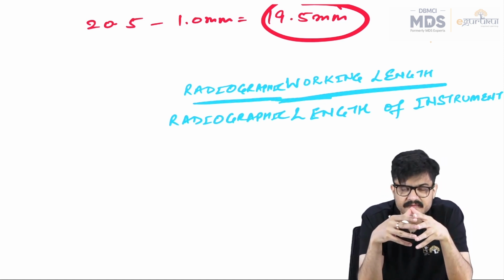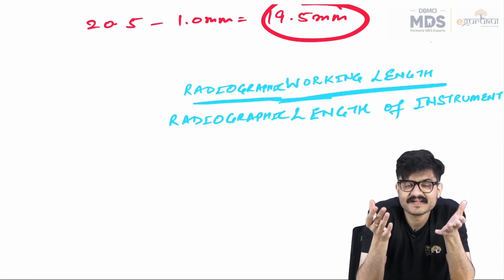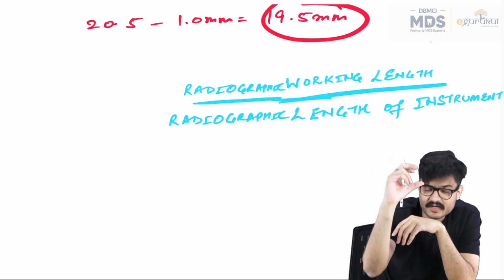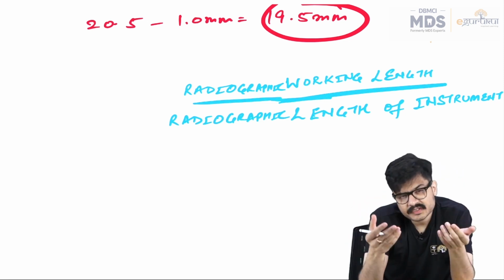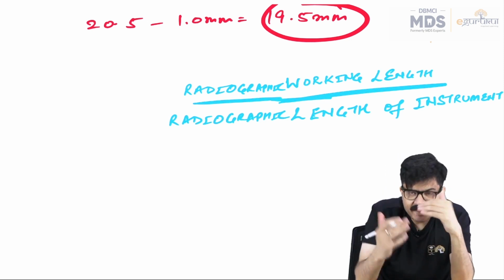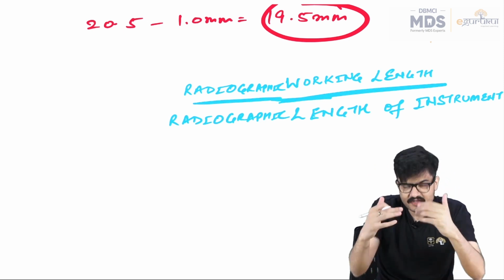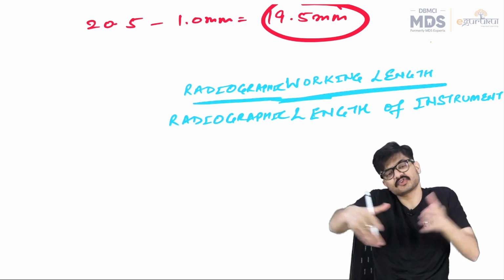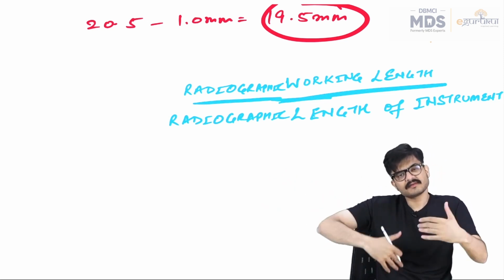This basically means that if I have an X-ray which is distorted, right, friends? On that distorted X-ray, my numerator would also be distorted by the same amount as my denominator. So this ratio would not vary. When we're talking of ratios, even if I have a distorted image, the numerator and the denominator would be distorted by the same value.